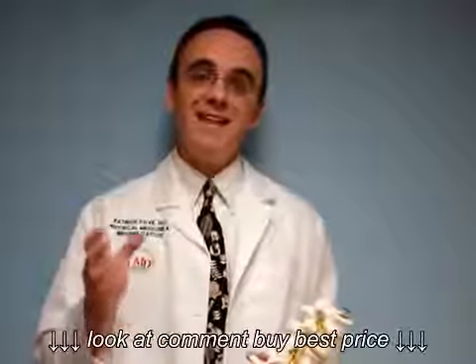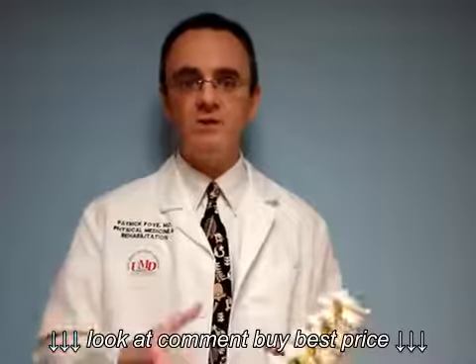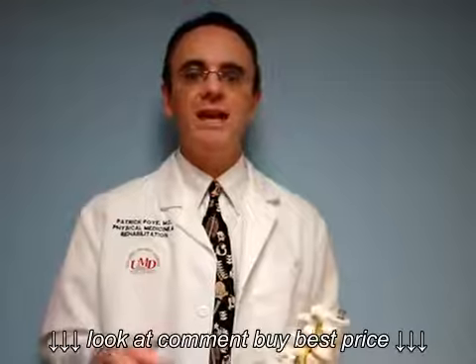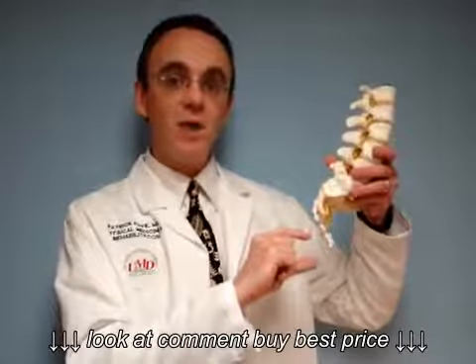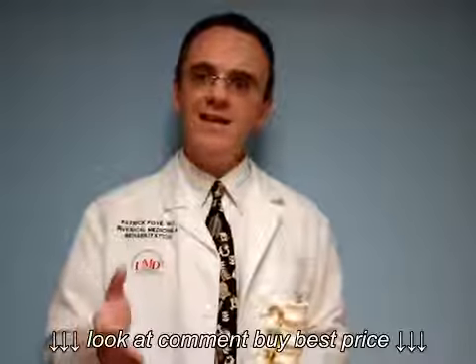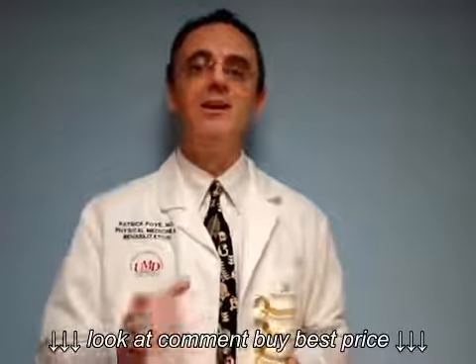The other thing you can do is to get a copy of the actual images. The radiology center may be able to just burn it onto a CD for you or loan you the actual films or images, and you can take a look at those and see whether you can actually see the tailbone included in those images or not. You can also take those images with you to your doctor's visit and ask your doctor to specifically point to the spot where the tailbone is on the x-rays.